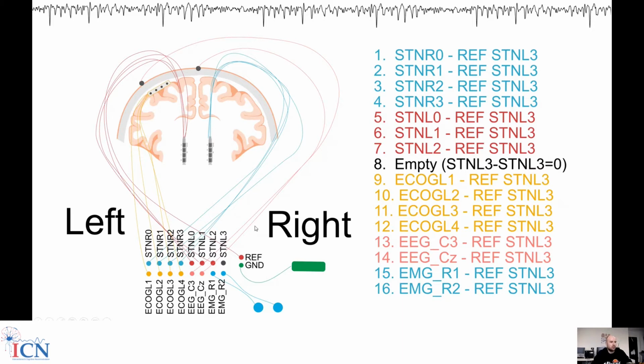Most electrophysiology processors require this, not all of them, but I think it will be the standard, as you will notice in your settings. What we use is an LFP channel. We basically sacrifice an LFP channel as a reference to make sure that we have a reference that is similar in terms of impedance to the other LFP contacts.